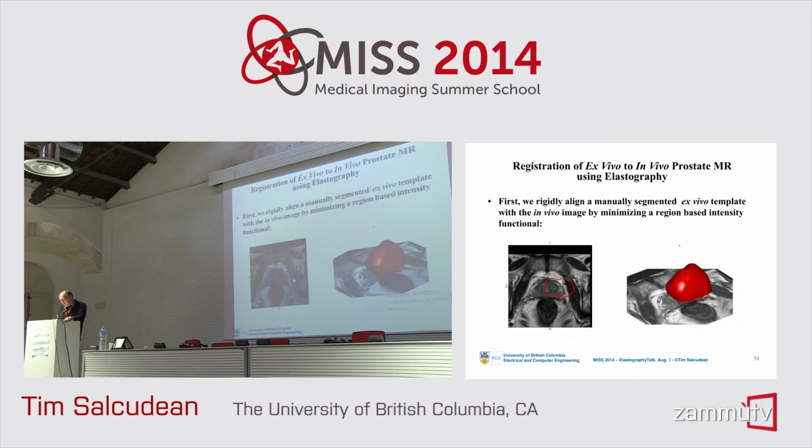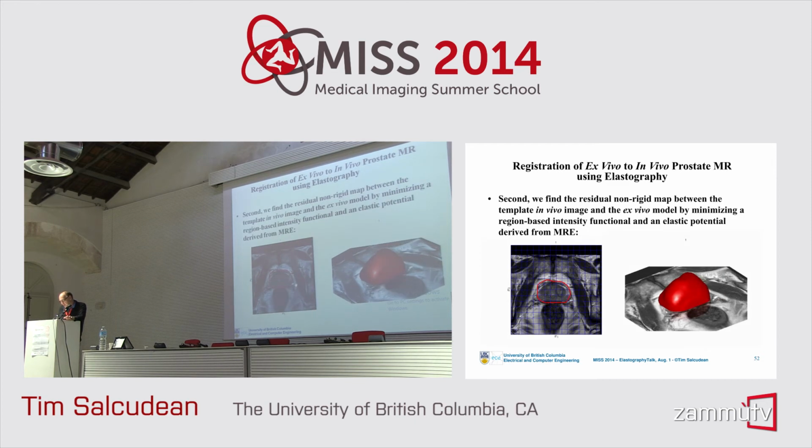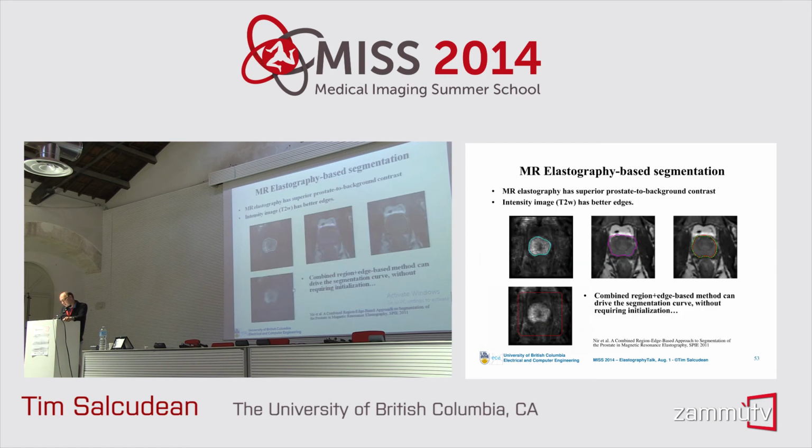And we have a first instance in which we actually have done MR to MR registration in order to register pathology to in vivo MR. And we have one step which does just a region-based intensity functional minimization that is actually regularized by an elastic potential derived from magnetic resonance elastography to have deformation which is actually consistent with the elasticity distribution of the organ.